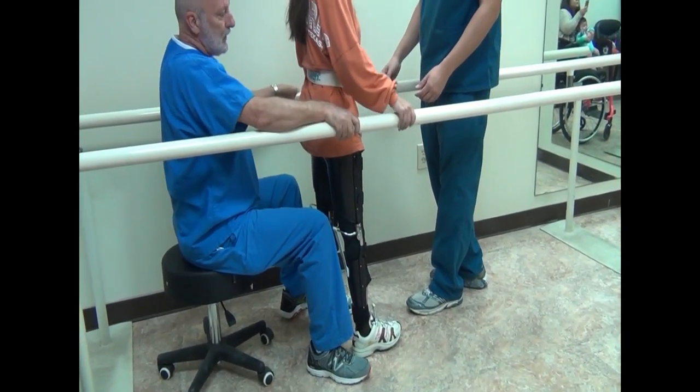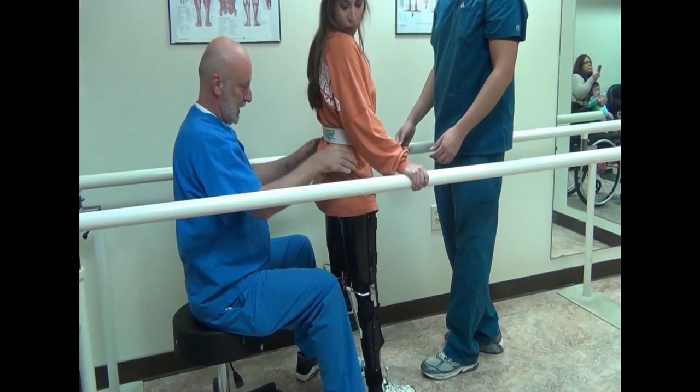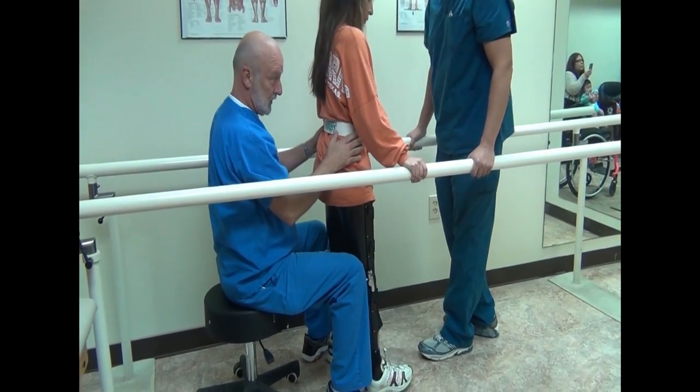Now I want you to do it again. Hold on to the bars because these aren't the most stable bars. Albert, if you would — I got her.